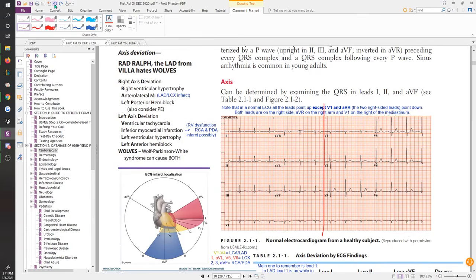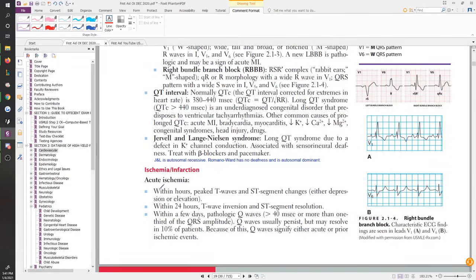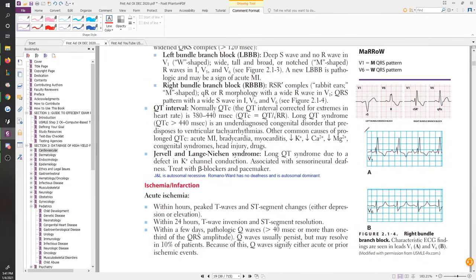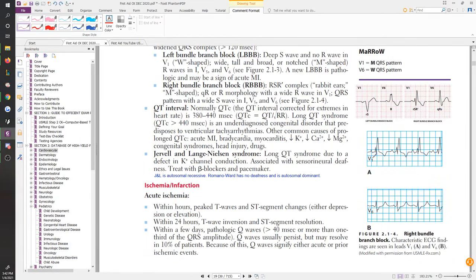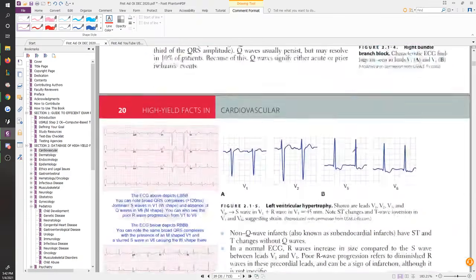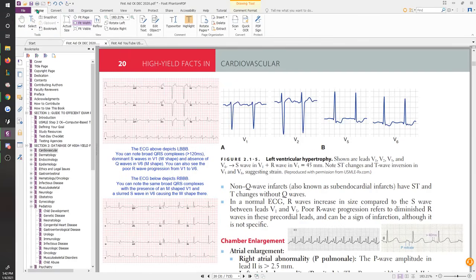But the Marrow, right? The Marrow is often harder to work with. It's actually not that straightforward to capture the Marrow design. So when you're looking for the Marrow issue to occur and you're looking for an M in V1, if it's pretty like this, you'll see it. If it's not so pretty, catching the M is often very difficult because V1 is very tiny to begin with, right? V1 doesn't look as big as they've shown you in the first aid image here. I'm not even sure if this is actually from a real ECG, but in the book itself, I've actually put some ECGs here to capture what you're going to be looking for.